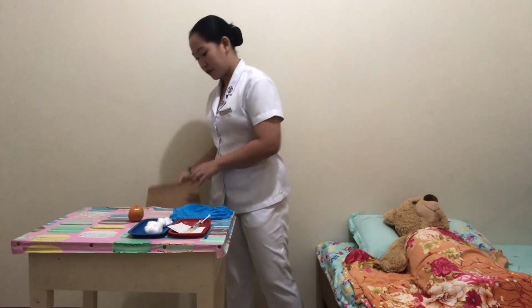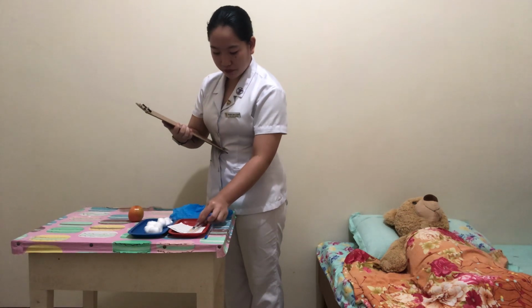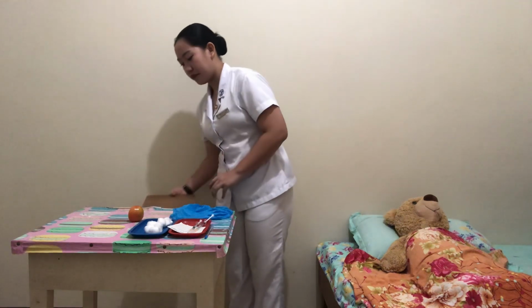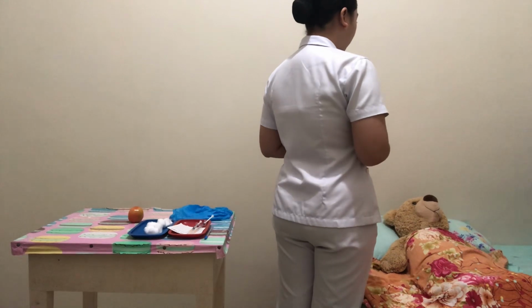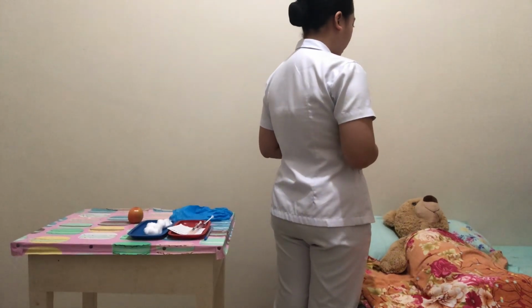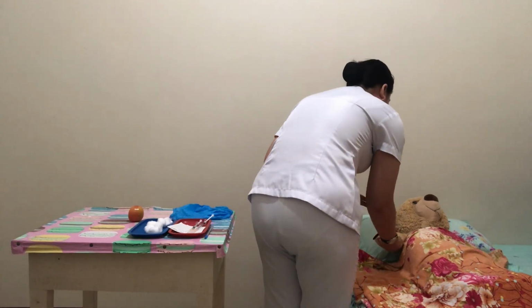So the first thing to do is check the doctor's order in the patient's chart. And then I'll introduce myself to the patient, verify the patient's identity, and also explain the procedure to the patient. So good morning, ma'am. I am Michelle J. Sevilla, your student nurse for today, and may I see your wristband, please? And kindly state your name and your birthday.